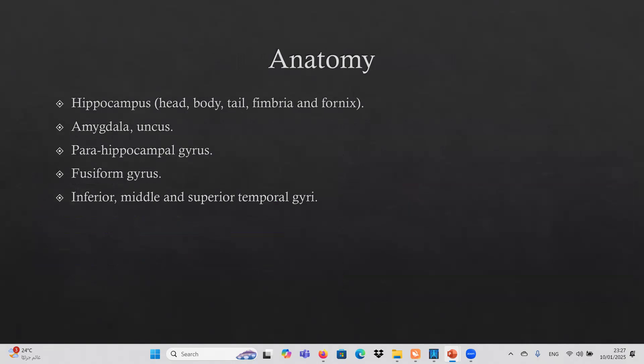Regarding anatomy, we will focus on the hippocampus — defining the head, body, tail, fimbria, and fornix — as well as the amygdala, uncus, parahippocampal gyrus, fusiform gyrus, and inferior, middle, and superior temporal gyri.